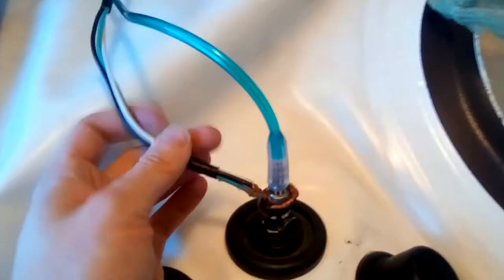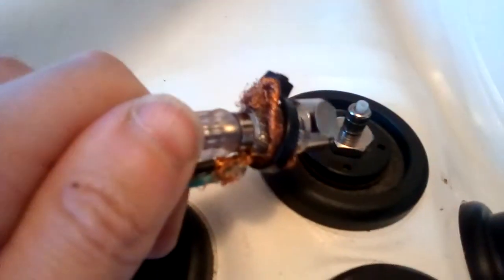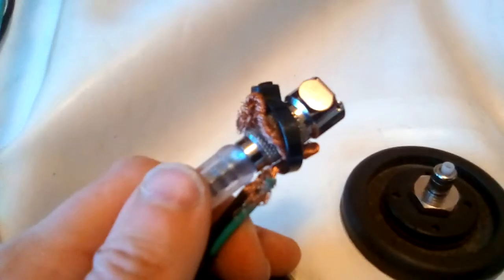And so the way that I ground it, that I have it grounded to the chamber, is on the other side. I have the extension cord, the longer extension cord, a separate one. I have the bare wire of all three of these wires connected around the oxygen hookup. So it's metal to metal. This metal connects to that metal. There's nothing tampering with the electrical connection right here. There's no rubber in between. So it's zip tied on there so it doesn't get loose. I connect that, and on the other side of this long extension cord, I chose a long extension cord because you never know where I'm gonna have to ground this, how far an outlet is.